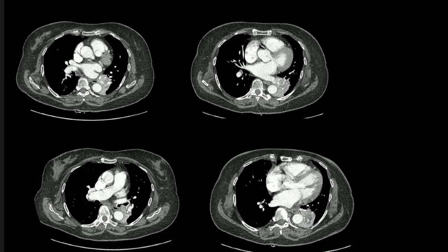Okay, and see the hypoenhancing part is encroaching into the left main bronchus. And if you see, there is some differential hyperdensity in the lesion. This is not a vessel, right? This is different than the vessels. This is calcification. Although it's difficult to say on these images. I agree, that's why I'm telling you. But calcifications, you should look at them.